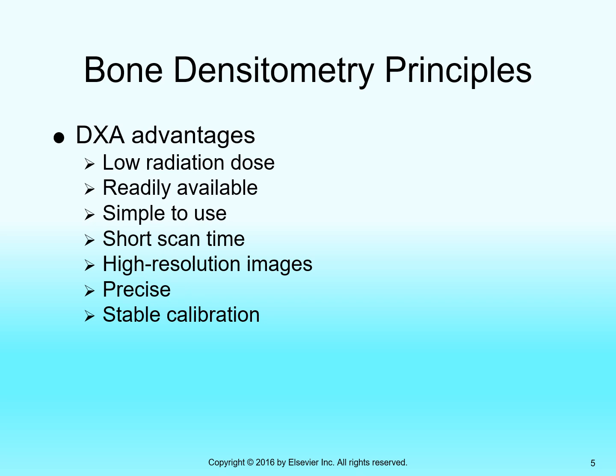And then compare those to previous exams in the archive and statistical averages, which are usually in the long-term memory of these things. Okay.